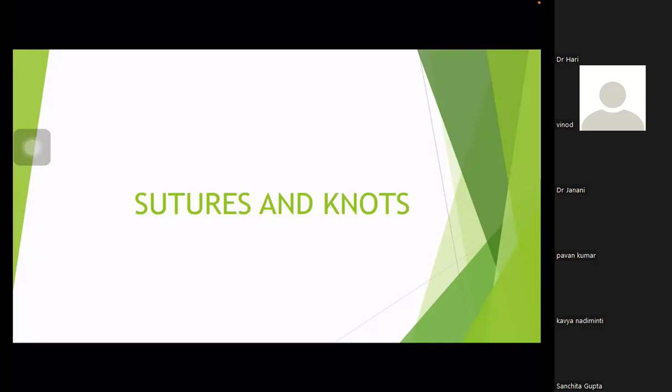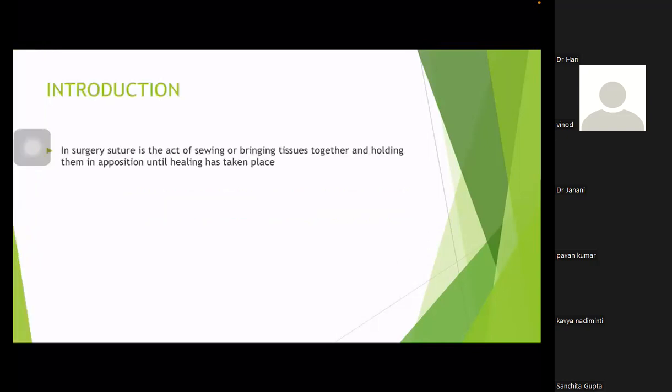Good evening to everyone. My name is P. Vinod Kumar, and I am a DNB first year PG. Today's topic is about sutures and knots. Introduction. Generally, suture is a material which is used for apposition of the tissues to improve the healing.